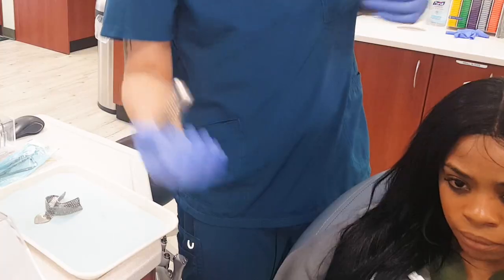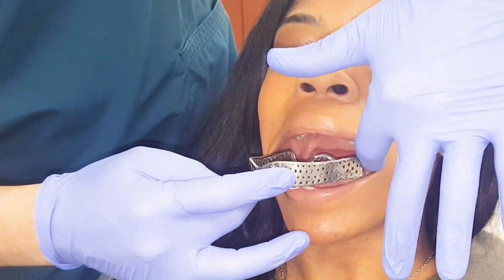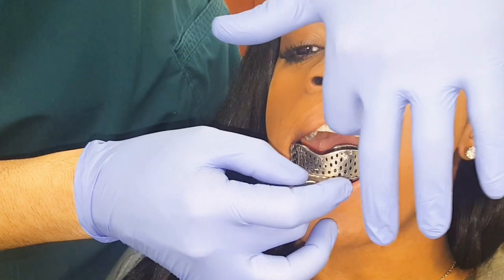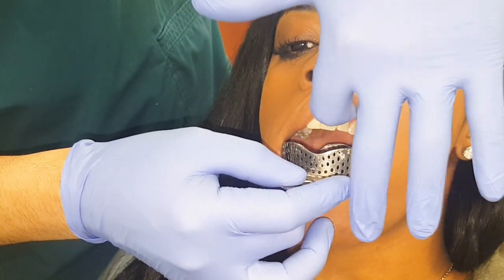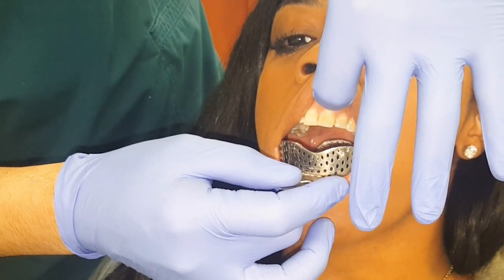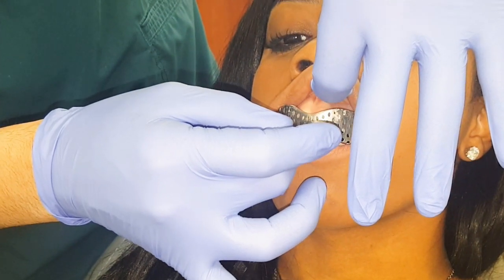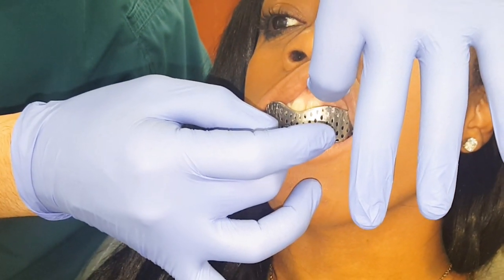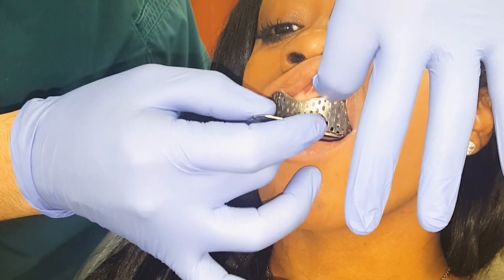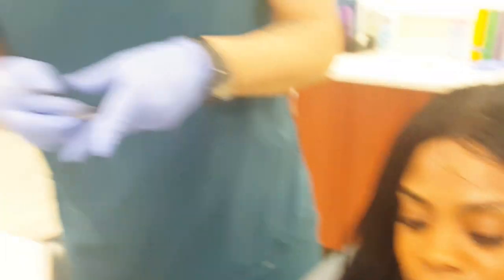We're going to start with the upper tray. This is Ree, by the way. Hi. Grab the tray and ask the patient to open really wide. Insert the tray. Sometimes the cheek muscle gets in the way of the tray seating all the way to the back. So have the patient close just a little bit — this allows you to go back even further. This tray looks fine. Ask the patient, are you okay? They say yes. Go ahead and take it out.